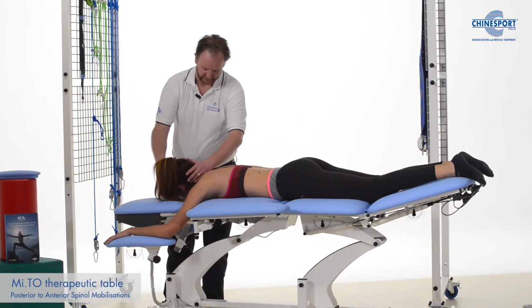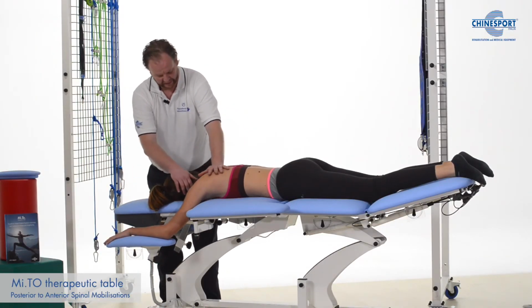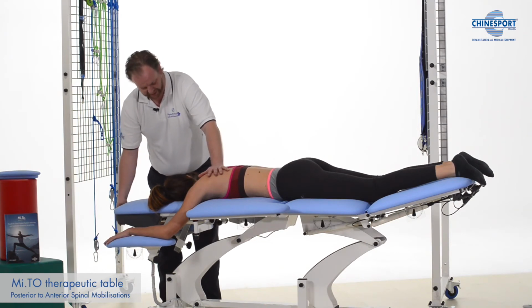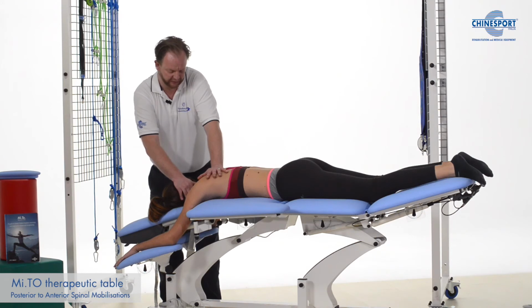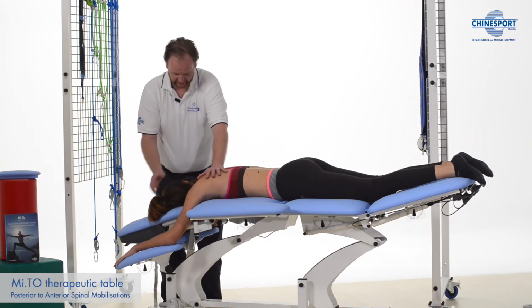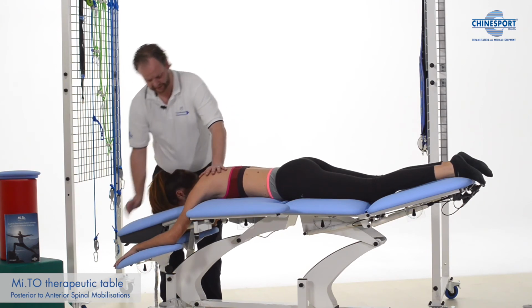Can you just move your head to the side? And here we can go into a stretch position. We can stretch the cervical musculature. Just like this. And you can go back. There we go.